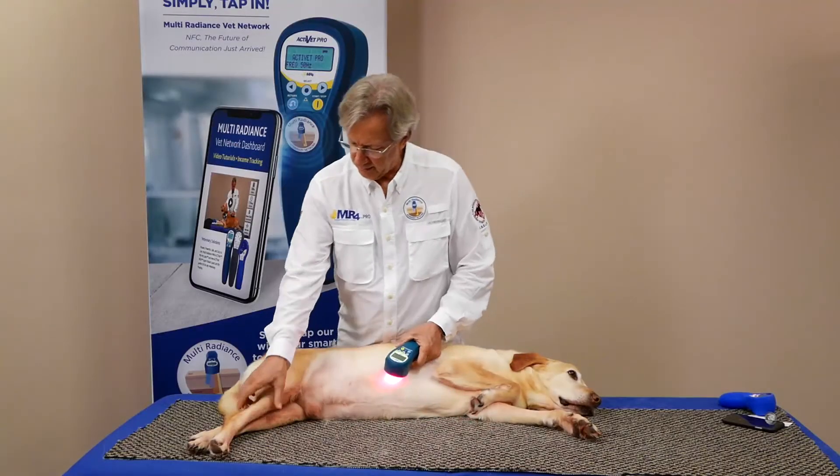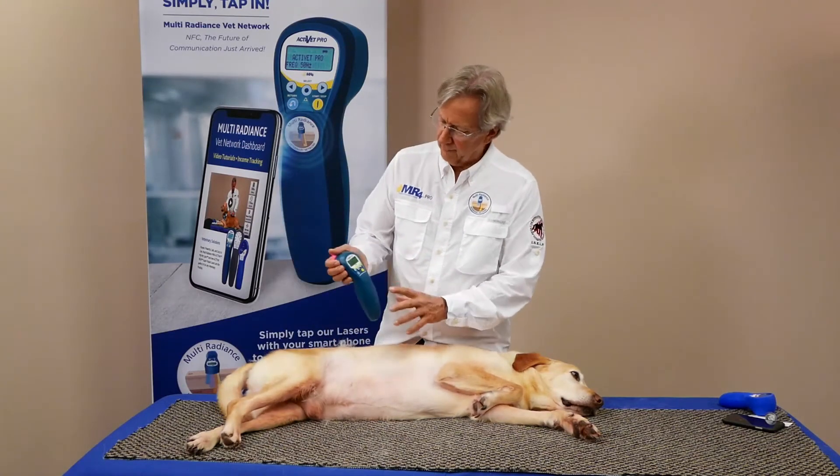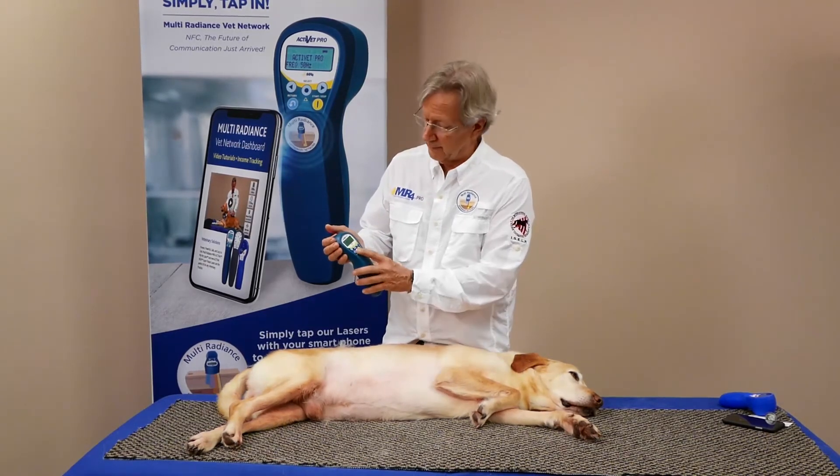Of course if it's in the back, you do the same thing, but it will be in the groin. And that's just how easy it is to use the Oshiro method, the woodpecker technique, to reduce swelling very, very quickly. You'll be amazed at how fast the fluid comes down.